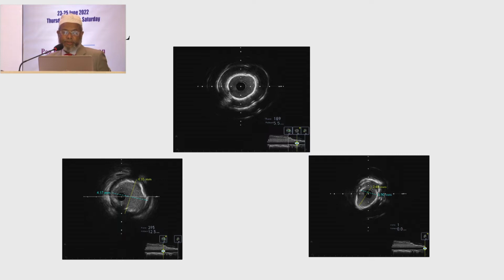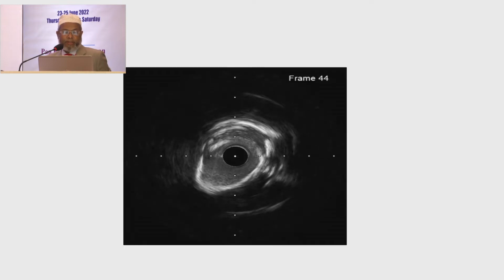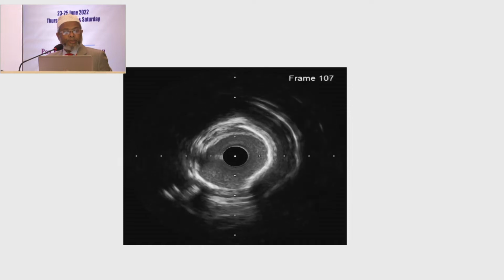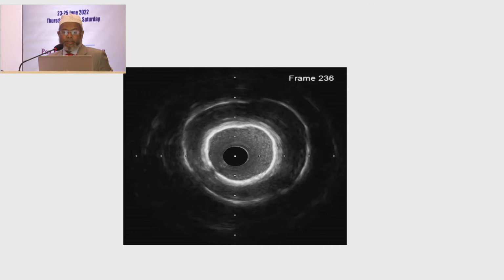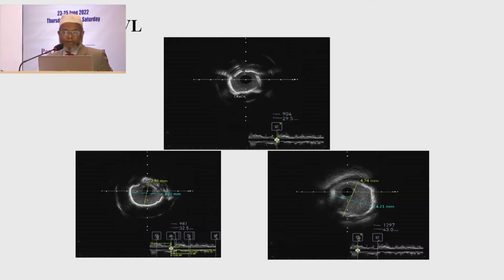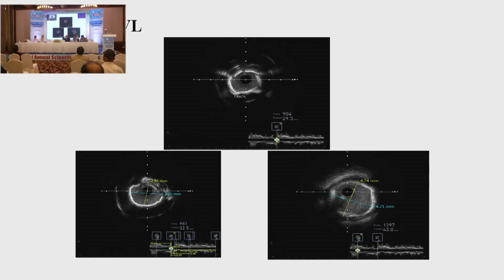360-degree calcification, and after pre-dilatation, after the pre-IVL run, almost 360-degree calcification. And this is after IVL. In the upper panel, you see at the 12 o'clock position, at 9 o'clock, 10 o'clock position, at 3 o'clock position, at 5 o'clock position, these are the fractures.